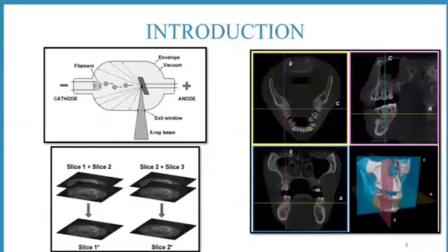The 2D conventional radiography is hampered by various technical hindrances like magnification, distortion, superimposition, and misinterpretation of the biological structures. A single 200-degree rotation over the region of interest acquires a volumetric data set. The scanning software collects the data and reconstructs it, producing what is termed a digital volume composed of three-dimensional voxels of anatomical data that can be manipulated and visualized with specialized software. 3D imaging opens the doors to accurate diagnosis and treatment planning.